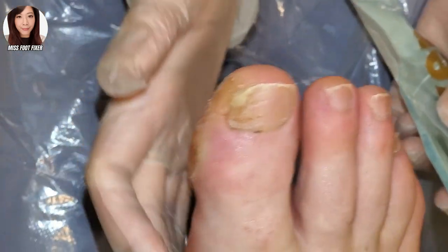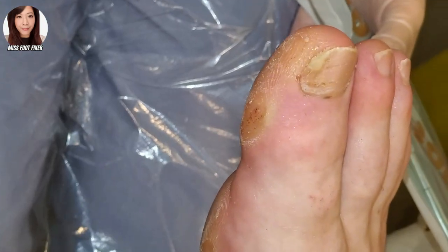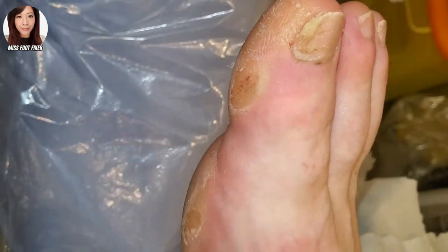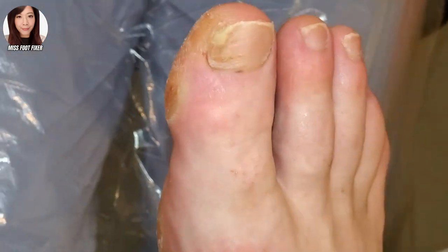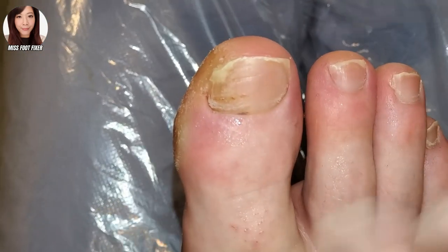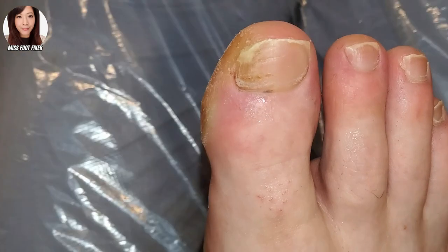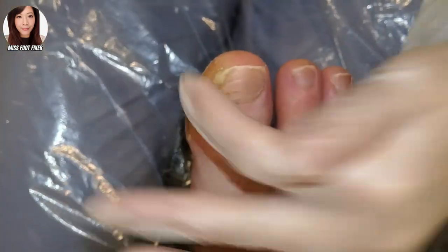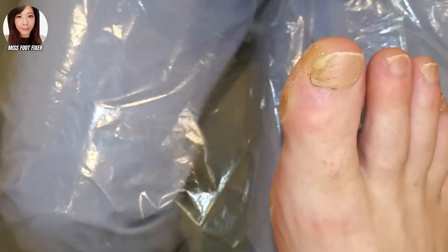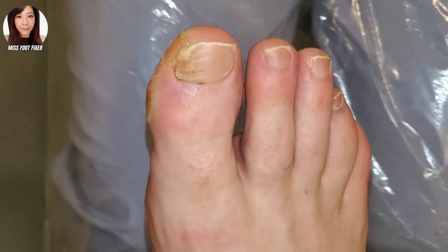If you look down the side here, we do see a lot of dead skin. So for all the people who are podiatrists, or who know feet really well, or are not podiatrists but are foot lovers — what do you think this big toe is doing? Why do you think this person has so much callus down the side, and why do you think these nails could be buckling upwards? Let me know in the comments.